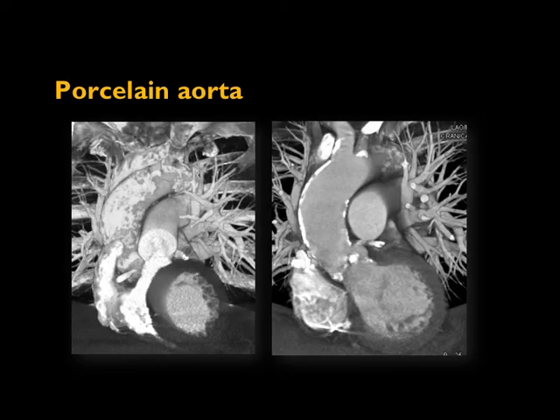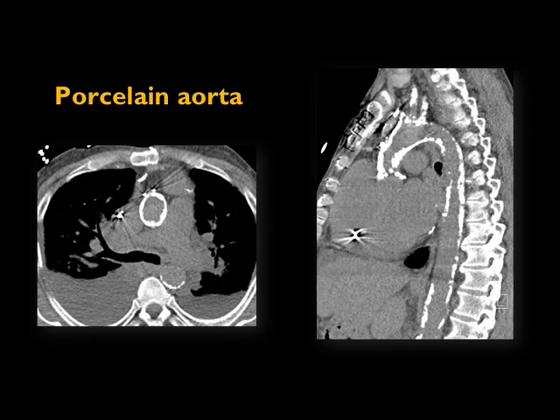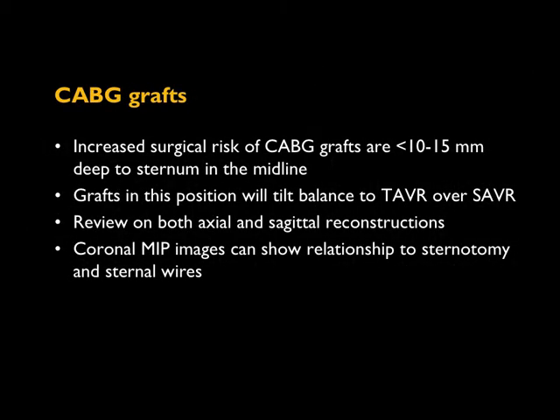Here's an example of a porcelain aorta with really extensive calcification — a terrible candidate for open aortic valve surgery and therefore a great candidate for TAVR. Another patient with extensive calcification similarly would not be a great candidate for open surgery. CABG grafts are important to report because they can tip the balance toward TAVR away from surgery, particularly if any grafts are less than one to one-and-a-half centimeters deep to the sternum in the midline, putting them at risk from the sternal saw.